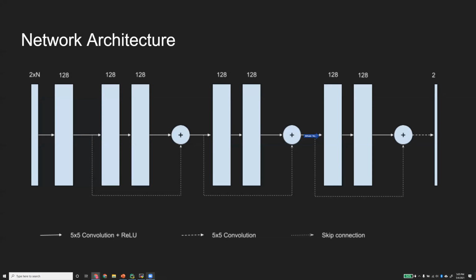In this case, our data is complex. We separate it into channels, with a real part and an imaginary part in both channels. We also have n images because we have n demodulations; in our case, we were using 11. Then it's very simple. Every arrow here is a convolution of 5x5 plus ReLU, and we also have some ResNet connections. We have 3 blocks where each has 2 layers of 5x5 plus ReLU. And then at the end, we have a single convolution to get to our final image, which is also complex.